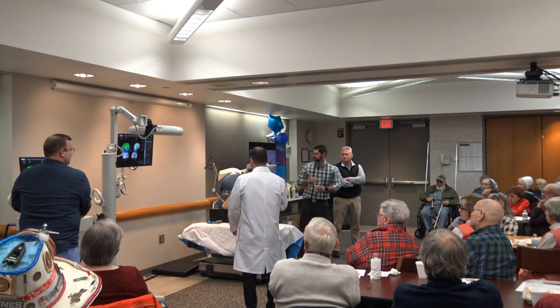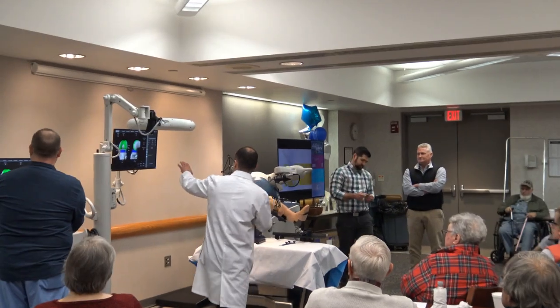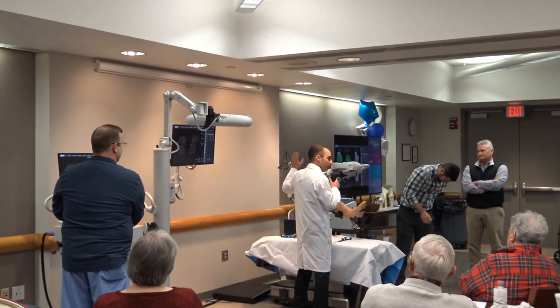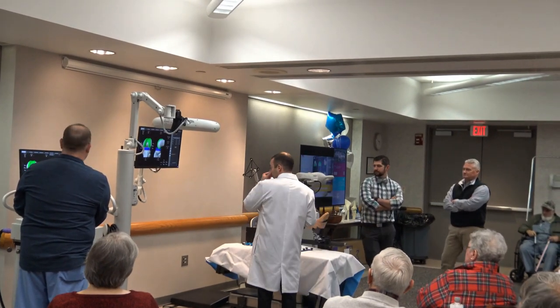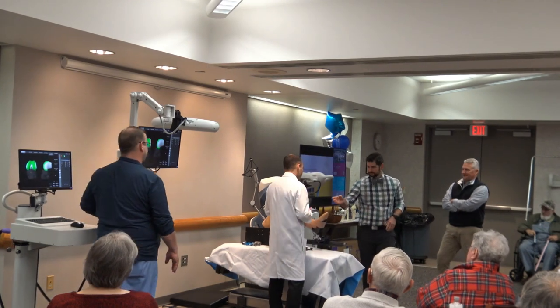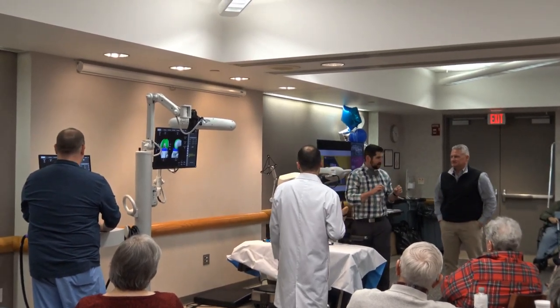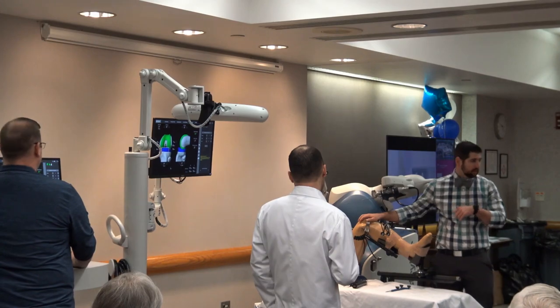So we're going to do the total knee application with the robot. We've already got our CT, placed and sized our implants as we think they best fit this patient. The next step, which we've already done here, is to register some points so that the robot and computer know exactly that the bone matches our model. Once we've done that, we do our balancing of the knee. The CAT scan is loaded in the computer; we've shown the computer where the bone is at.